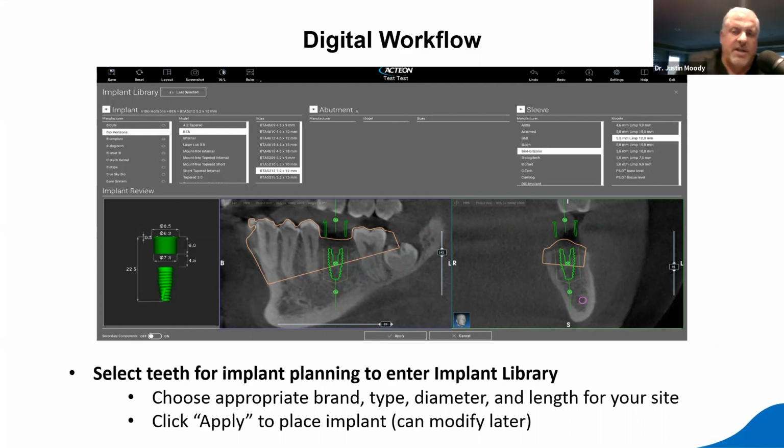Because guided surgery, I know it makes us more efficient. I know it makes it safer. It makes us easier. But truly, what makes it easier for me is getting it parallel between those contact points, or understanding which contact point I may need to disc or flatten or recontour to allow for the implant final prosthesis to be exactly what we're looking for.